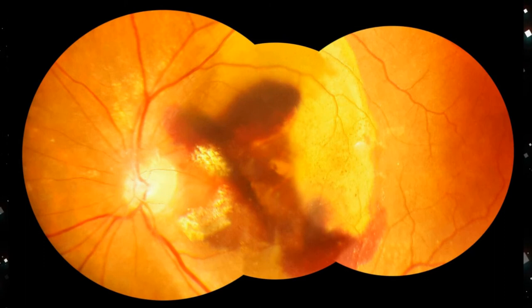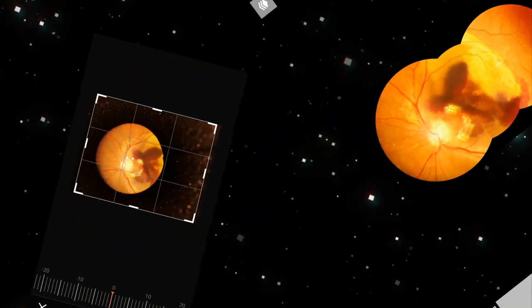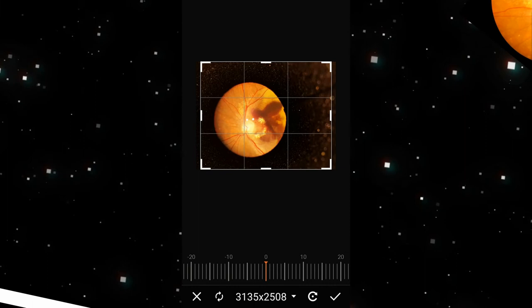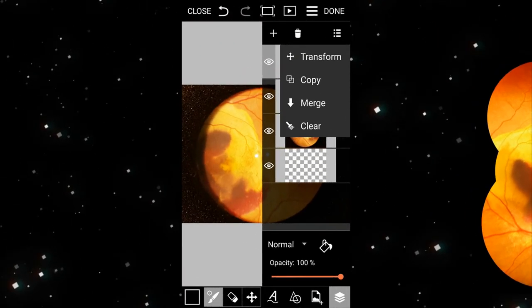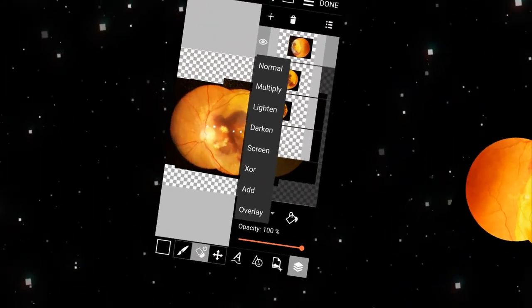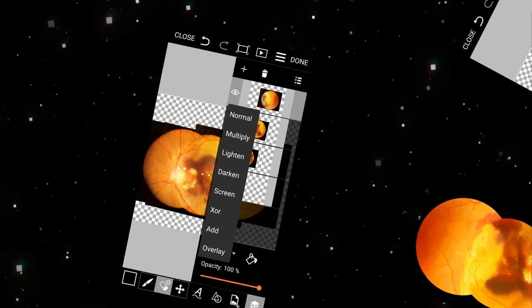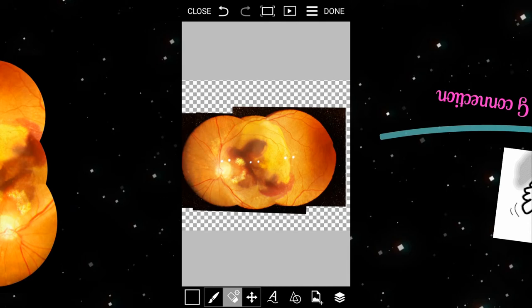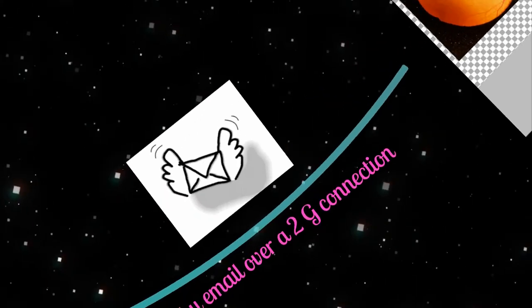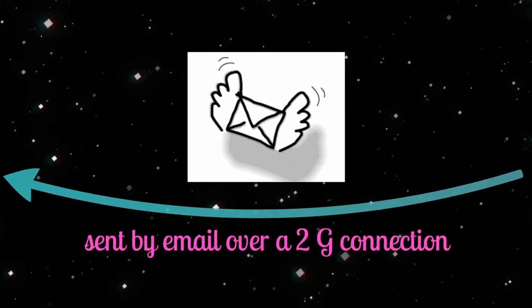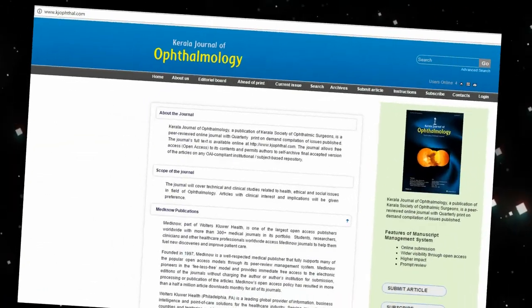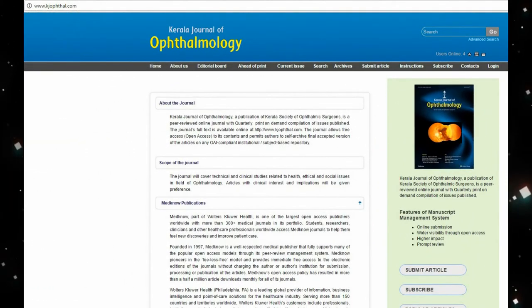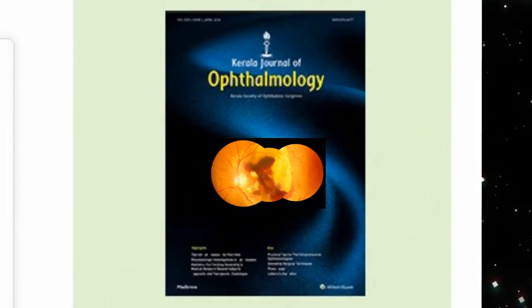This is a photograph of wet AMD with submacular hemorrhage. This image was captured on the smartphone using the direct cam. The images were then edited on the smartphone and a montage was created from three such images. The image was then sent by email over a 2G connection to the editor of Kerala Journal of Ophthalmology as the cover picture of the journal's first online issue, thereby highlighting the role of smartphones in teleophthalmology.